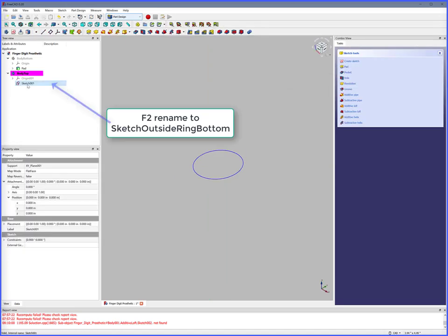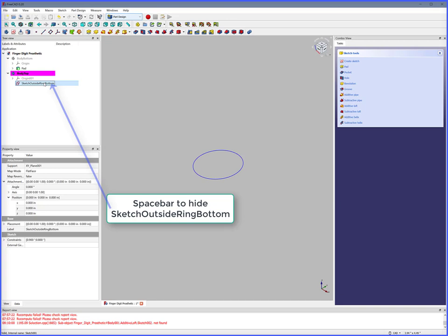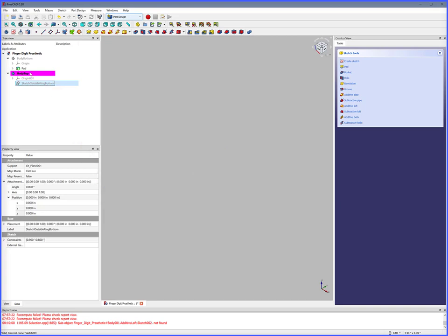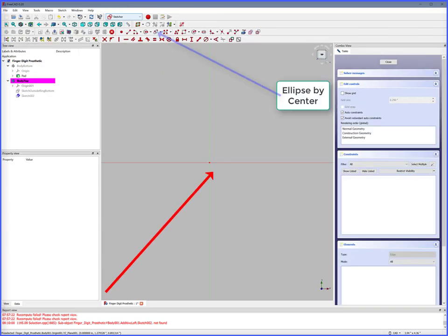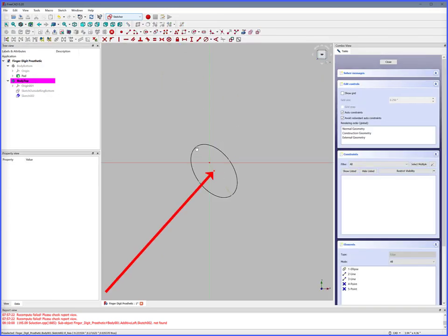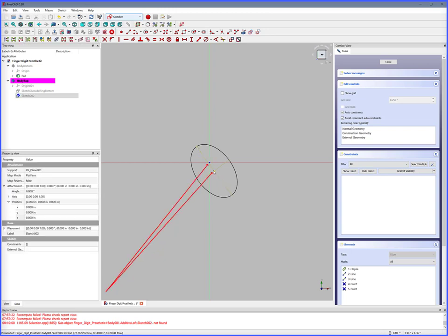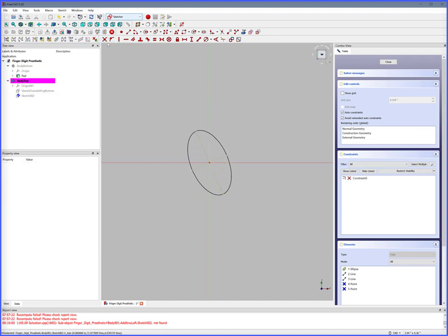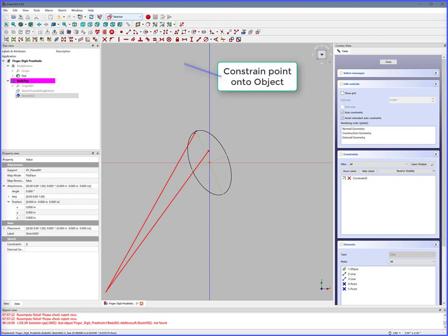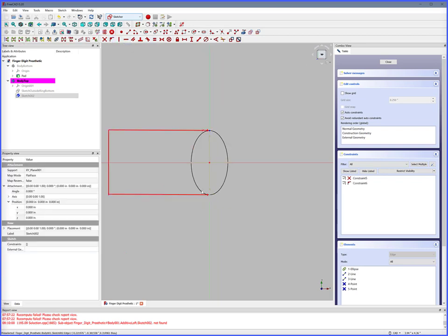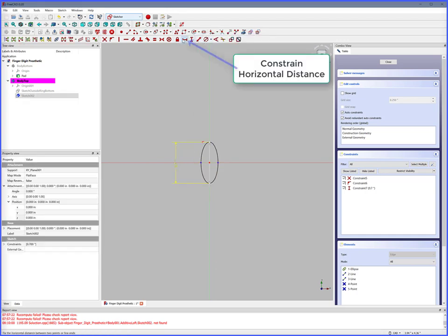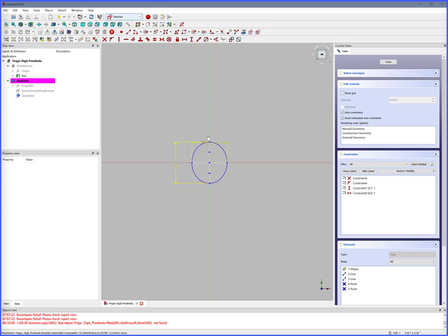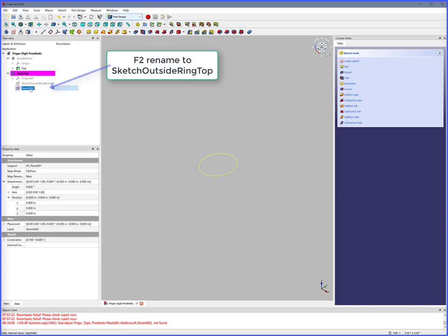Close. F2 to rename to Sketch Outside Ring Bottom. Spacebar to hide Sketch Outside Ring Bottom. Next, create top ellipse ring. Double click Body Top, Create Sketch, XY Plane, OK. Ellipse by center, click, double click to complete, right click to release. Select XY center, select center of ellipse, Constrain Coincident — now centered. Select ellipse point, select Y axis, Constrain Point Onto Object — now symmetrical. Select Y points, Constrain Vertical Distance — cylinder outside Y diameter is 0.7 inches. Select X max points, Constrain Horizontal Distance — cylinder outside X diameter is 0.6 inches. Close. F2 to rename to Sketch Outside Ring Top.